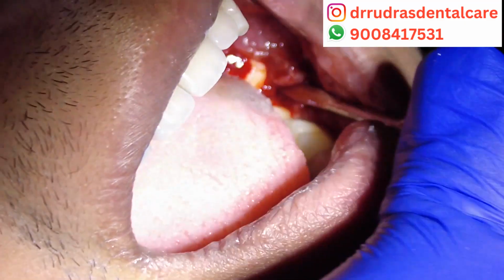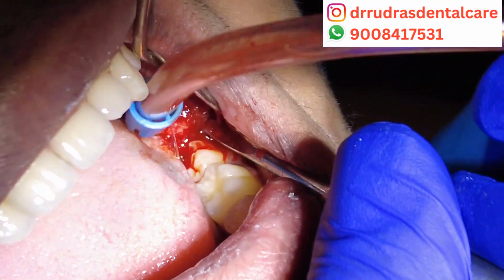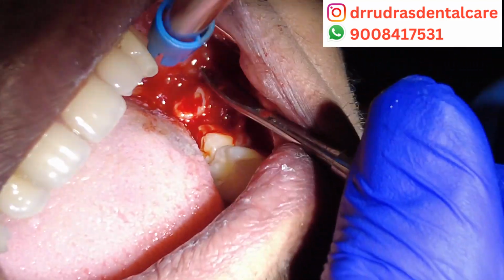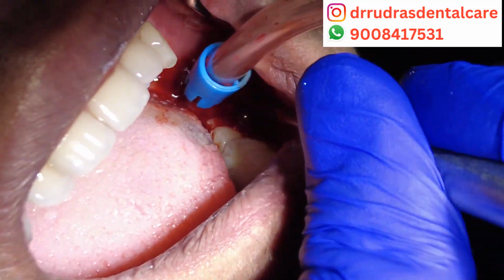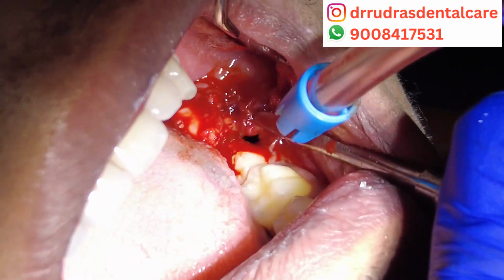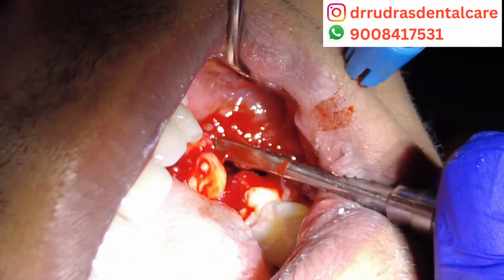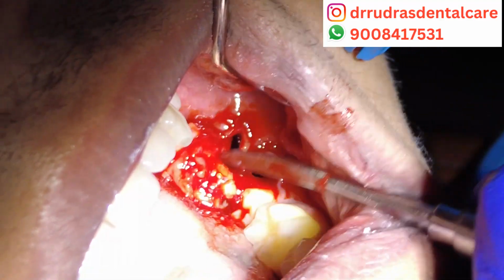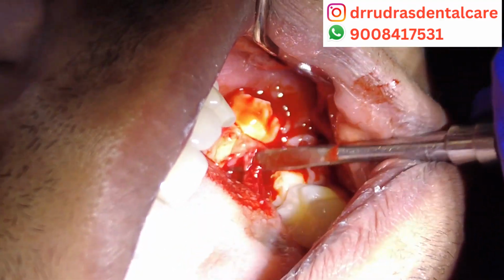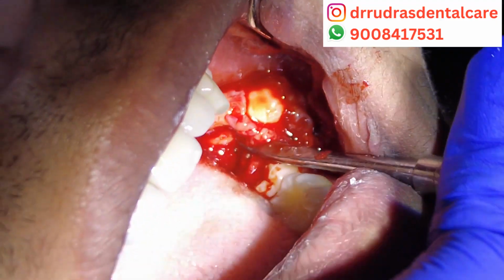Now, while most of the tooth is out, we were very happy, but its attachment to the underlying socket was still very thick. We could appreciate a bulk chunk of periodontal and granulation tissue, and that's why the tooth wasn't coming out very easily. So we tried to dissect it out, blunt dissection, and we tried to remove the attachment apparatus of the tooth which it was connected to with the alveolar housing.